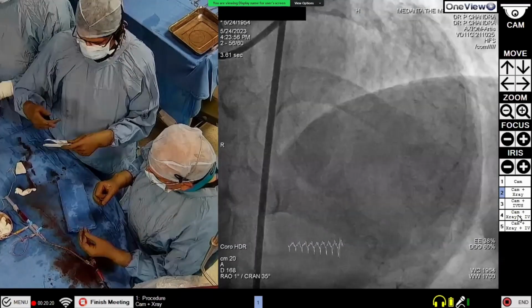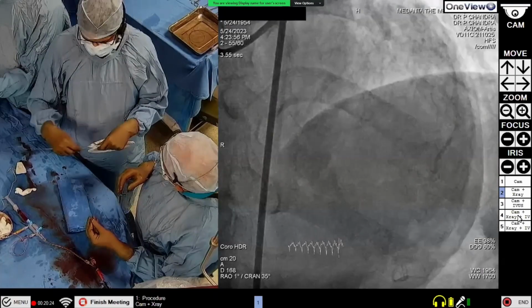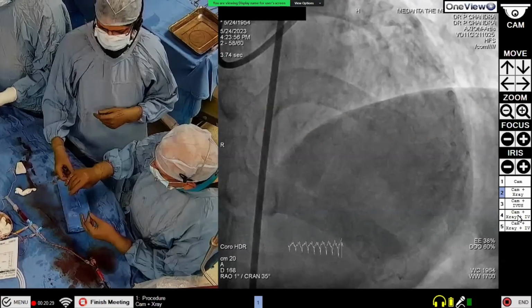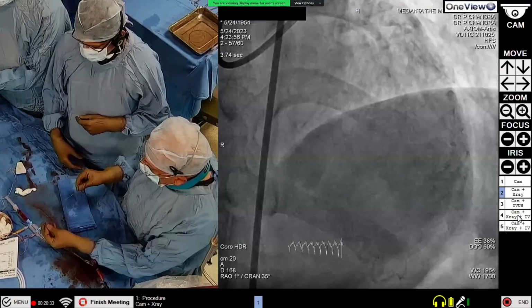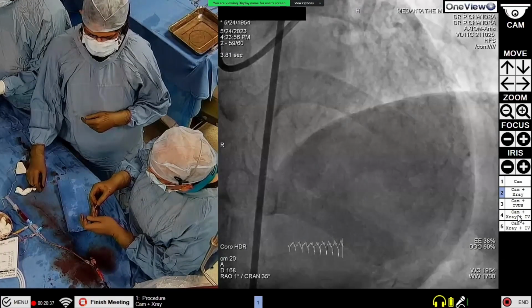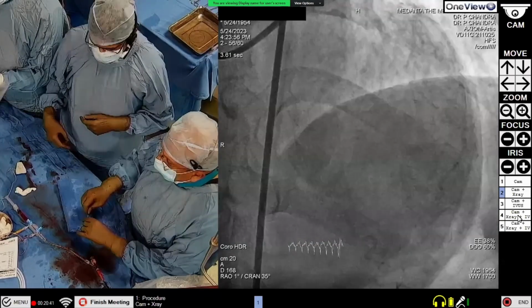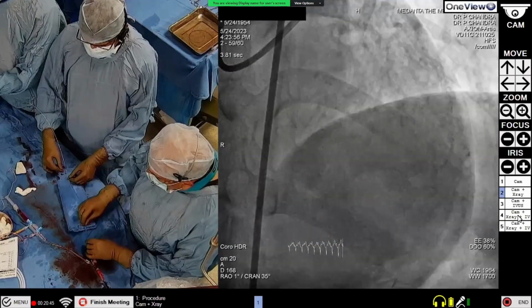Dr. Vince, you have done so many patients now. Have you seen any patient coming back with thrombosis or restenosis after leaving them without a stent? Oh yeah, that is a good question. When we do these kind of complex stentings, certainly the chance of having a stent thrombosis is higher than normal situations. One, that it is a tapered stent. Two, it will be most likely if it is a two stent technique.